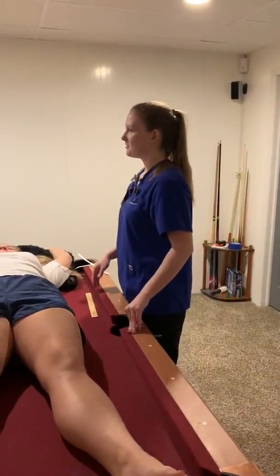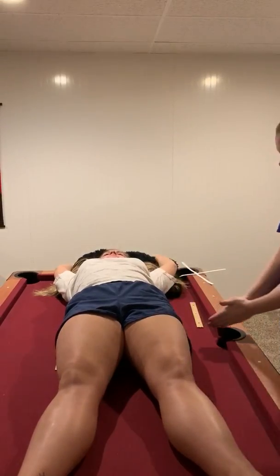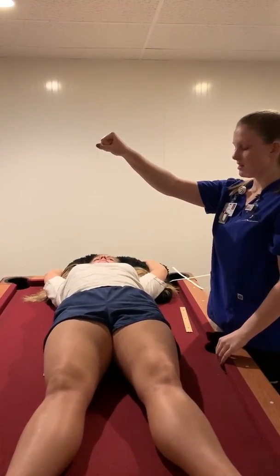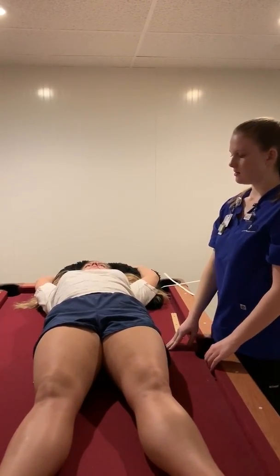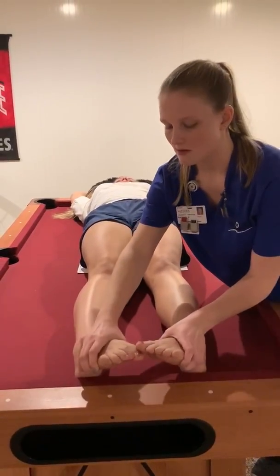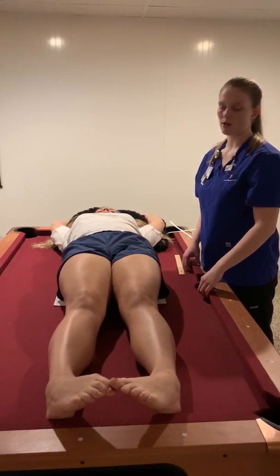I would put the tube into detent, and I'd line it up to where the IR is in the table bucky, make sure it lines up. And then I would make sure that it's in detent transversely, and that the SID is 40 inches. And then I would have her rotate her legs in 15 to 20 degrees. This is so it places the femoral necks parallel to the IR.